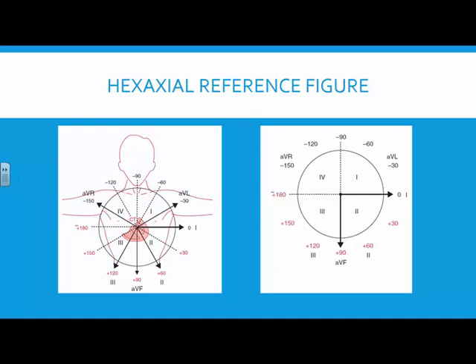Well, the term lead kind of goes interchangeably with your sticky dots and with all that. Like 6 pictures? Yes, 3 leads, 6 pictures. That's 100% correct. That's 100% correct. Because you are not getting a view of the same section. It's from different sections. Okay?